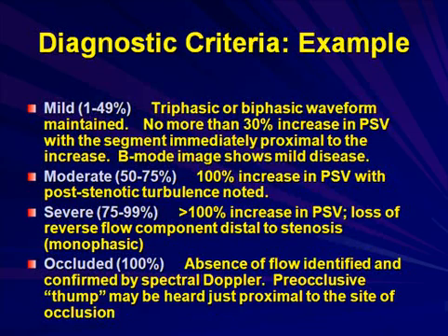This is an example of diagnostic criteria. Some centers will use greater than or less than 50% stenoses. Others will break that down further into 50 to 75 and 75 to 99 based on these criteria.